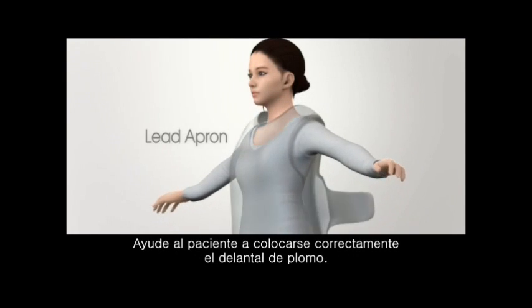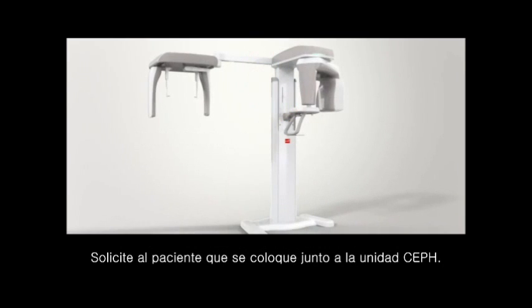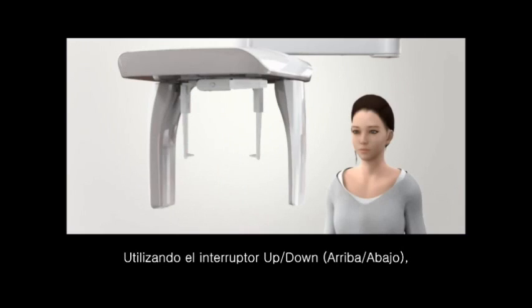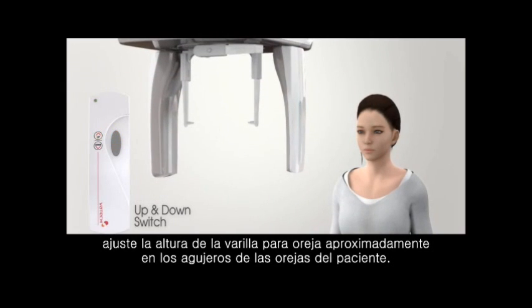Assist the patient to appropriately wear the lead apron. Be careful, the lead apron is not above patient's neck. Ask the patient to stand next to the CEF unit. Using the up-down switch, adjust the height of the ear rod at patient's ear holes approximately.